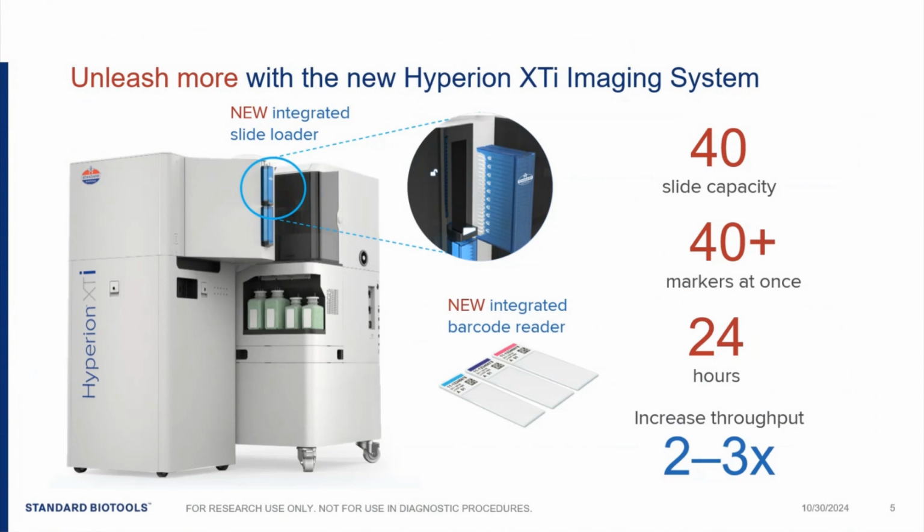I'll go into the details of that technology in just a second, but just to keep it high level, this instrument is used for analyzing spatial biology of tissue sections that fit on your standard microscopy slide. It has a capacity to visualize 43 unique targets all at one time on a single tissue sample. Coming from a background of standard immunofluorescence and live cell imaging, I've shifted from looking at about 3 or 4 targets at one time to now 40 plus targets.